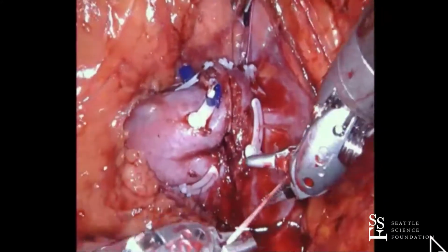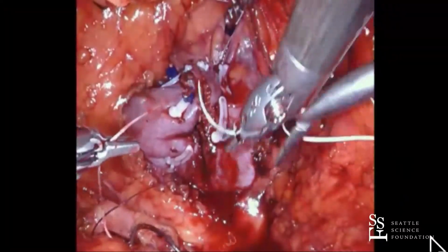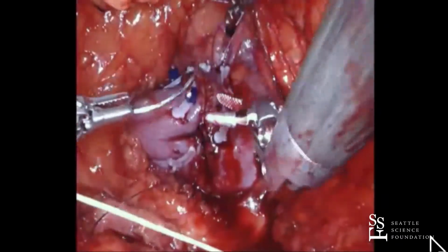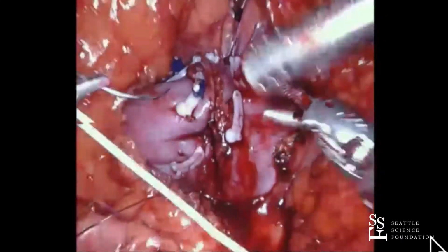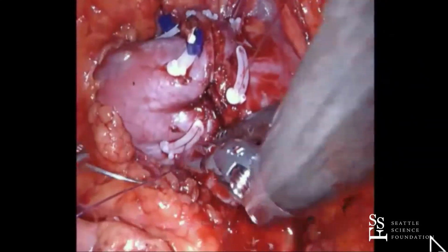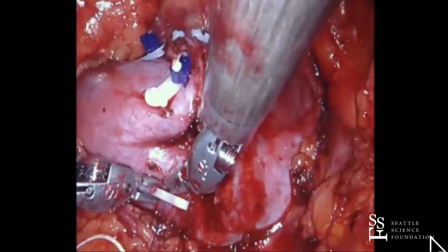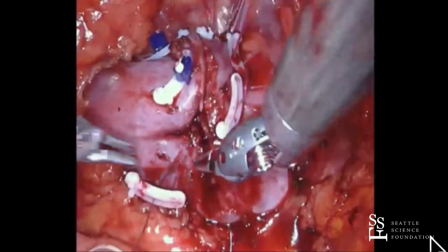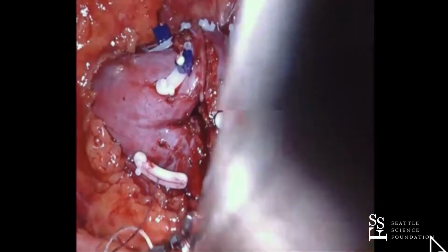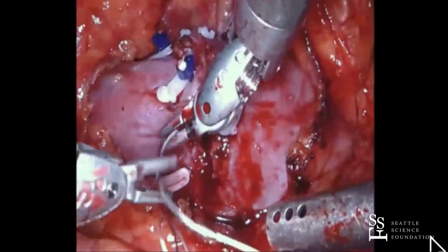I don't think there's really any good evidence that these hemostatic agents make a difference. I don't think anybody's really done any level one studies. So I think it's just dealer's choice. It's whatever you feel comfortable with. It's important to be cognizant of cost and trying to keep your cost down. But if you do a dozen a year, or maybe 20 a year, relatively low volume, then really your priority is just good outcomes. Cost is not going to be the number one priority. If you're doing 100 or 200 a year, then obviously these things add up, but then you're probably not somebody who needs those extra agents.